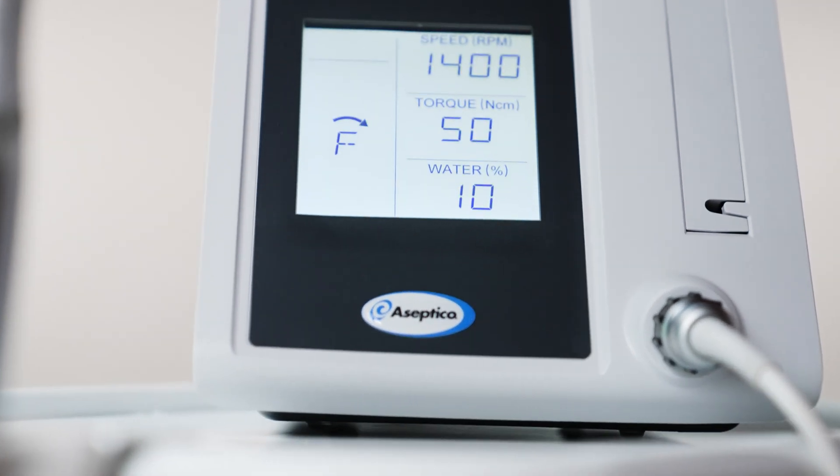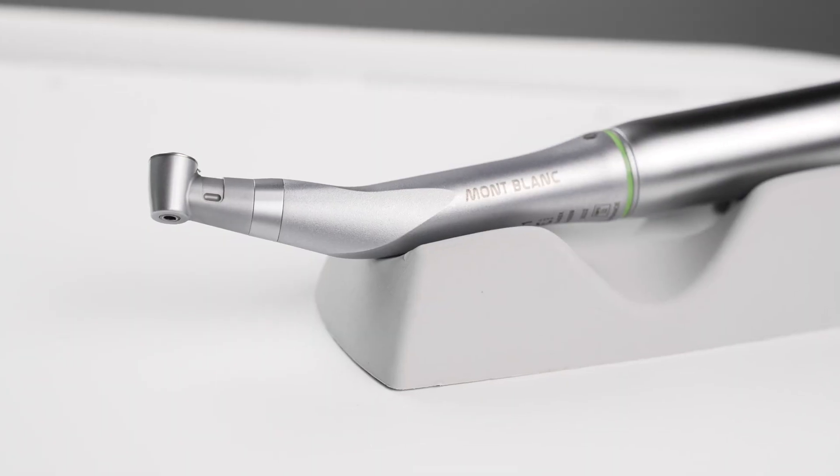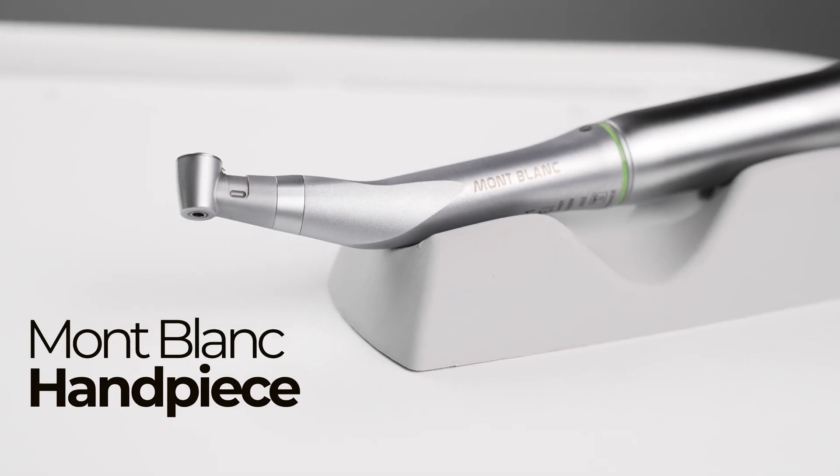It is a great option for dentists seeking an easy-to-use, reliable, powerful implant motor that focuses specifically on implant procedures. The Asseptico 1070 features a powerful brushless 40,000 RPM motor that can place implants up to 70 Newton centimeters using a 20 to 1 reduction handpiece, such as the Mont Blanc line sold by Asseptico.